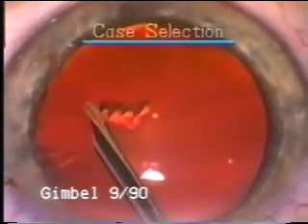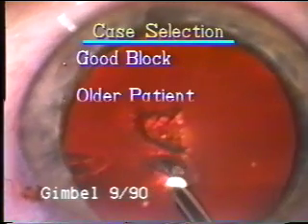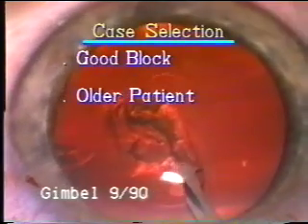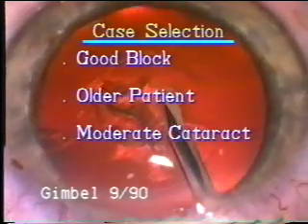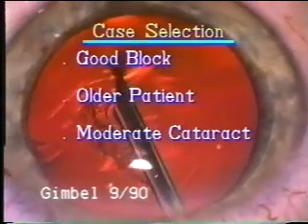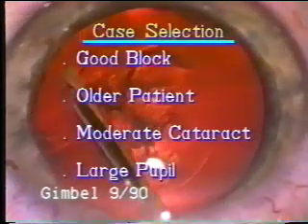For those of you who have not used continuous curvilinear capsulorhexis, I'd like to talk about the basics of the technique and how I would suggest you get started. I would choose a case that has no vitreous pressure, no orbital pressure — in other words a good block — and not a young case where there might be intralenticular pressure in soft cataracts, but an average cataract that still has good reflex but not a real elastic capsule and not a brittle capsule, with a good-sized pupil so that you get a good reflex.